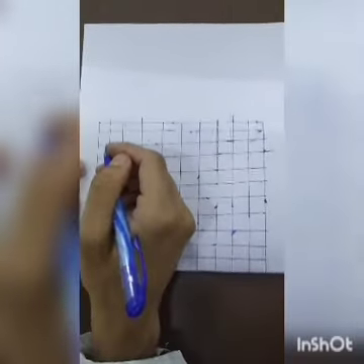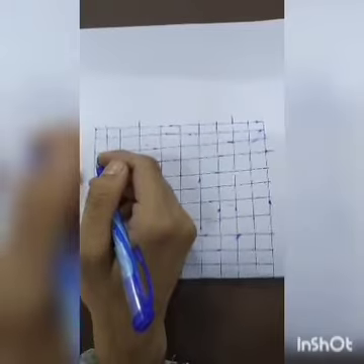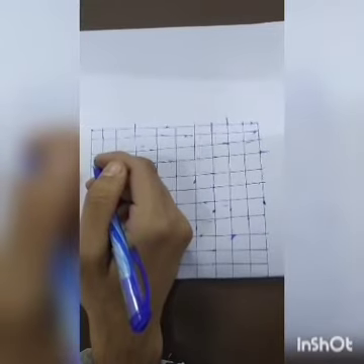Draw a table of 100 squares for various WBCs. Identify and enter the WBCs using the letter N for neutrophils, M for monocytes, L for lymphocytes.